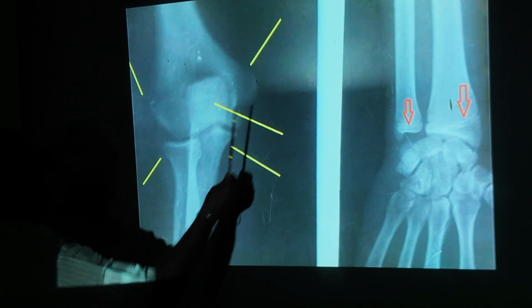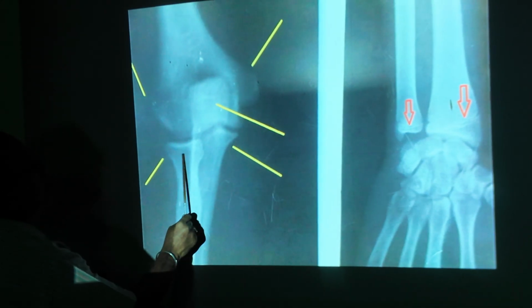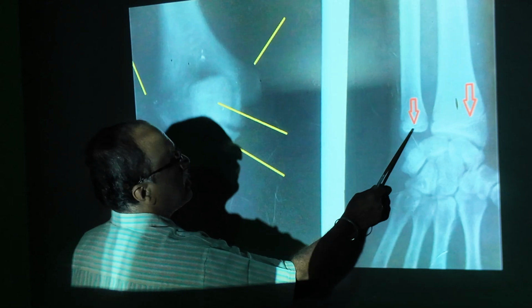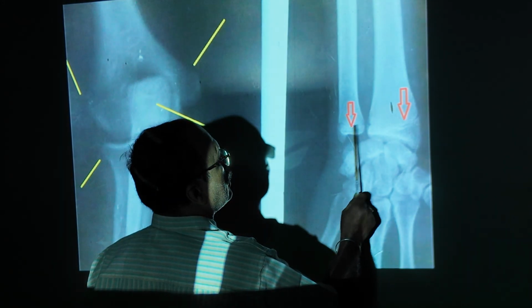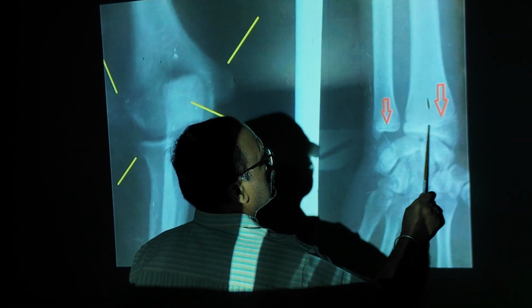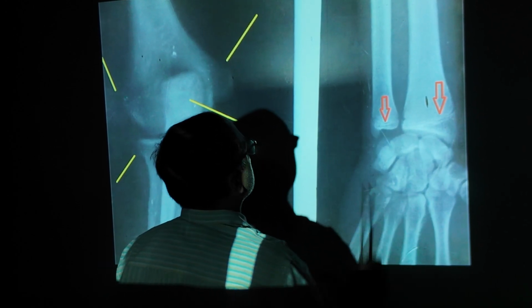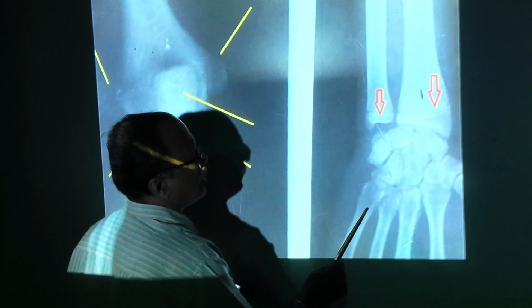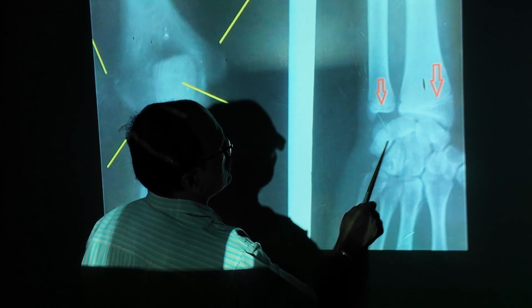In this X-ray, you can see the medial epicondyle and lateral epicondyle. Everything is fused. Upper end of radius, upper end of ulna, everything is fused. This age not less than 17 years. You can narrow down the upper limit. This lower end of the radius, lower end of ulna, these two are about to fuse. Fusion is already started. This part is fused, this part is not fused completely. So less than 19 years, 17 to 19 years. Proximal end of the first metacarpal bone is fused and pisiform bone is appeared.